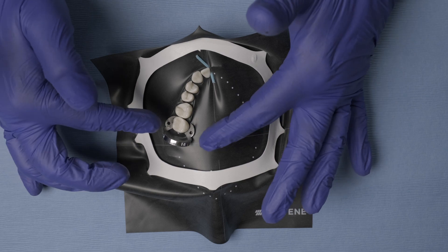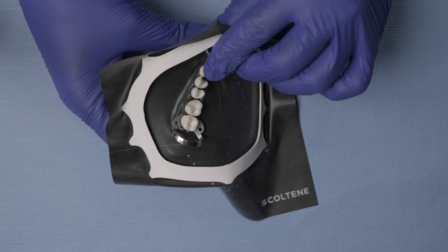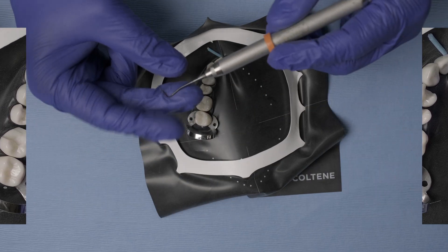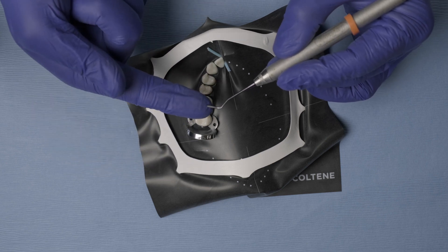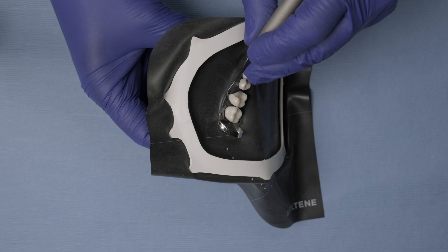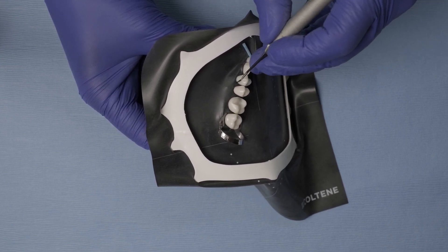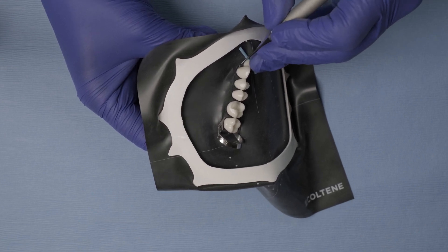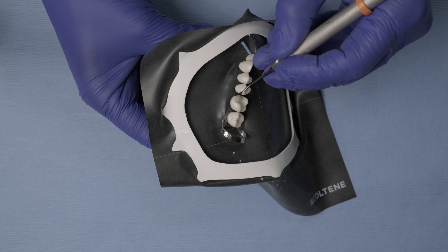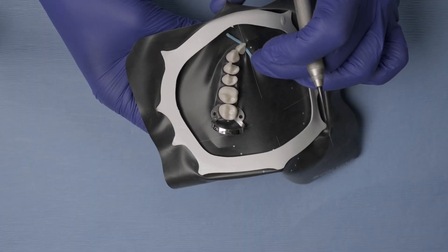A common problem when isolating multiple teeth is that the rubber dam sometimes does not invert itself correctly — it ends up covering areas you need access to. An easy solution is to use a composite instrument, a narrow blunt spatula. You don't want anything sharp that can tear your rubber dam. Clinically, go and follow the natural contours of the tooth. By displacing the rubber dam along these natural contours, you can easily get the rubber dam to invert correctly underneath the gingival margin. This step is crucial because once the rubber dam inverts into the gingival sulcus, we prevent any crevicular fluid or blood from contaminating our operative field. All margins are then completely exposed, clean, and ready to be restored.